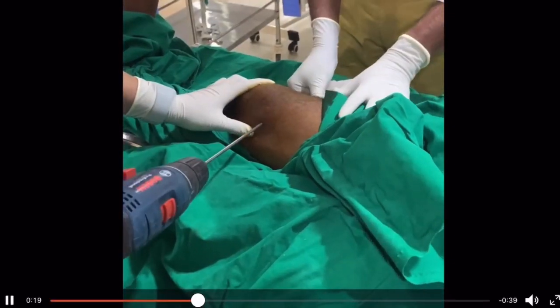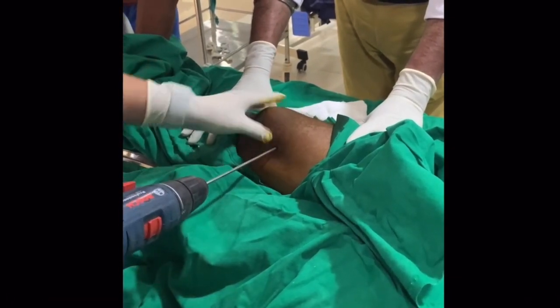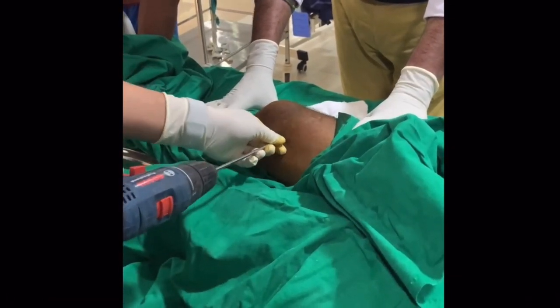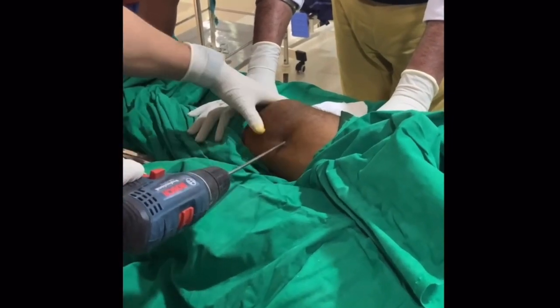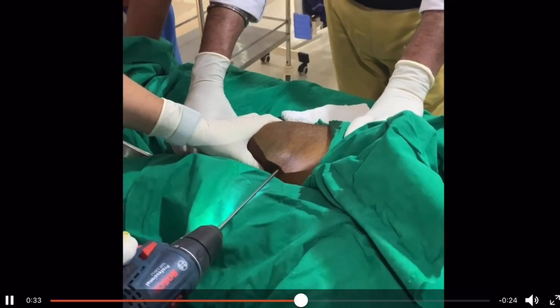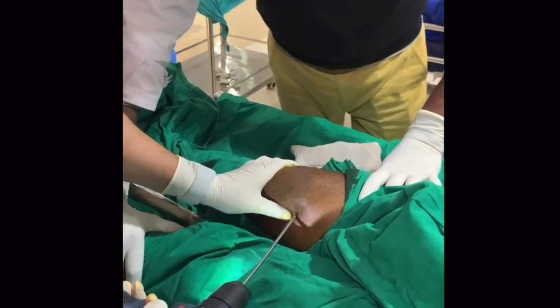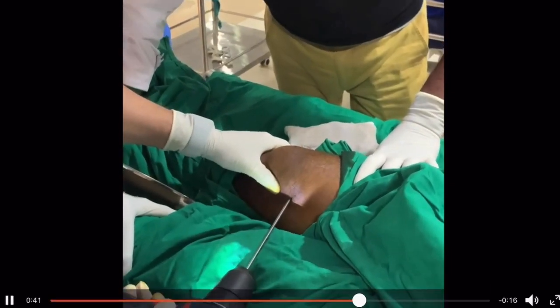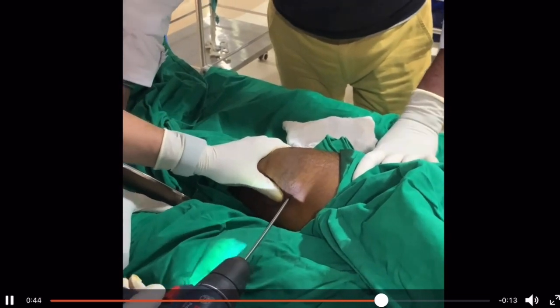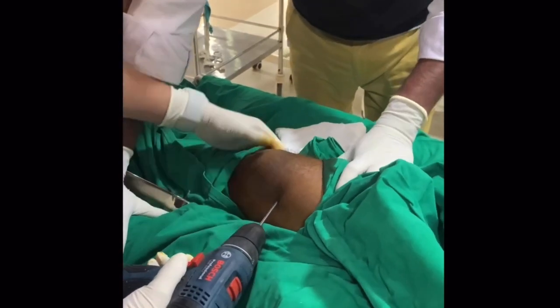Take the Steinmann pin, go inside, and palpate the anterior and posterior border of the femur. Palpate the supracondylar flare of the femur — that's where the adductor tubercle is. Then insert the pin, either manually with the handle or using an electric drill. Make sure the pin is perpendicular to the long axis of the leg and parallel to the floor.